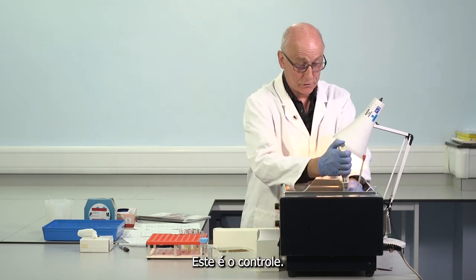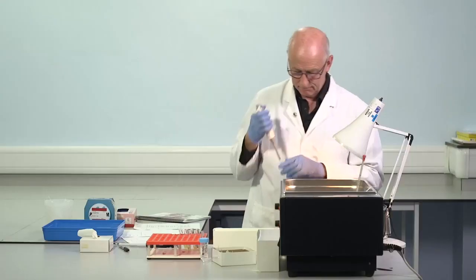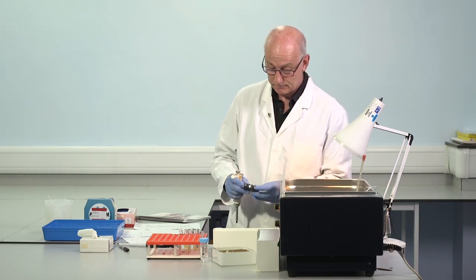APTT reagent, this is the control. This one also has a 3-minute activation time.